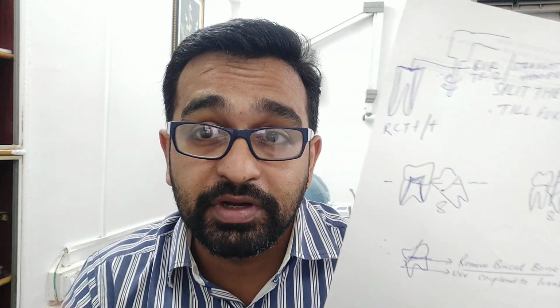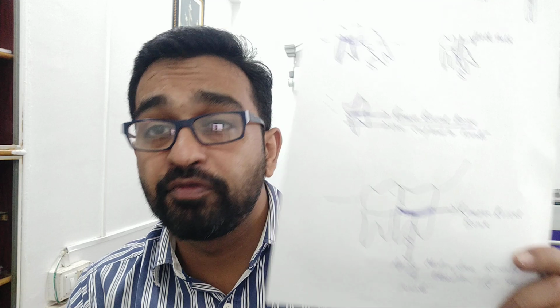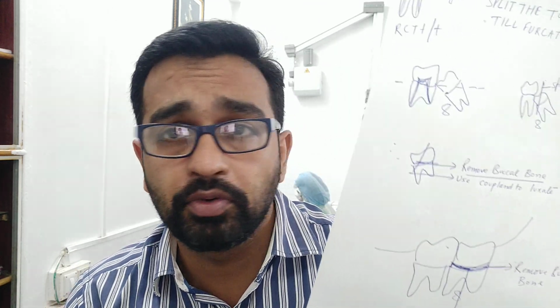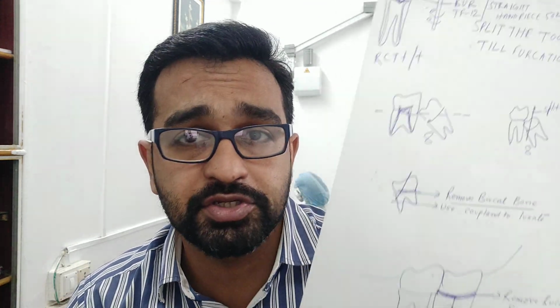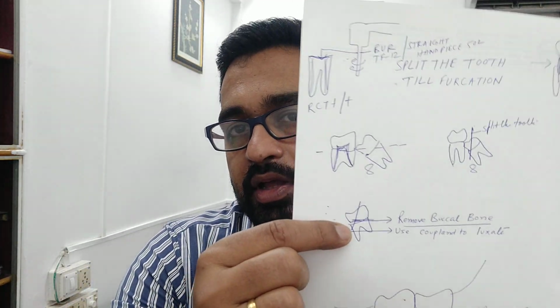So give the block also very nicely. That is also very important. ठीक है, patient should not get discomfort. Till the anesthesia doesn't happen, don't do the treatment. Even if the patient has to wait for half an hour. So this is the condition, and you have to see where the tooth actually is.